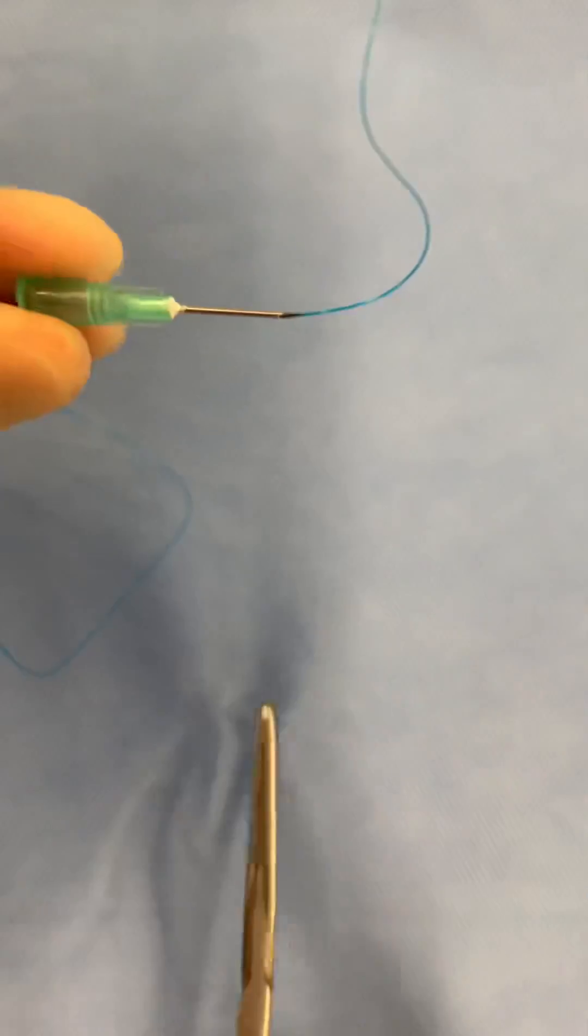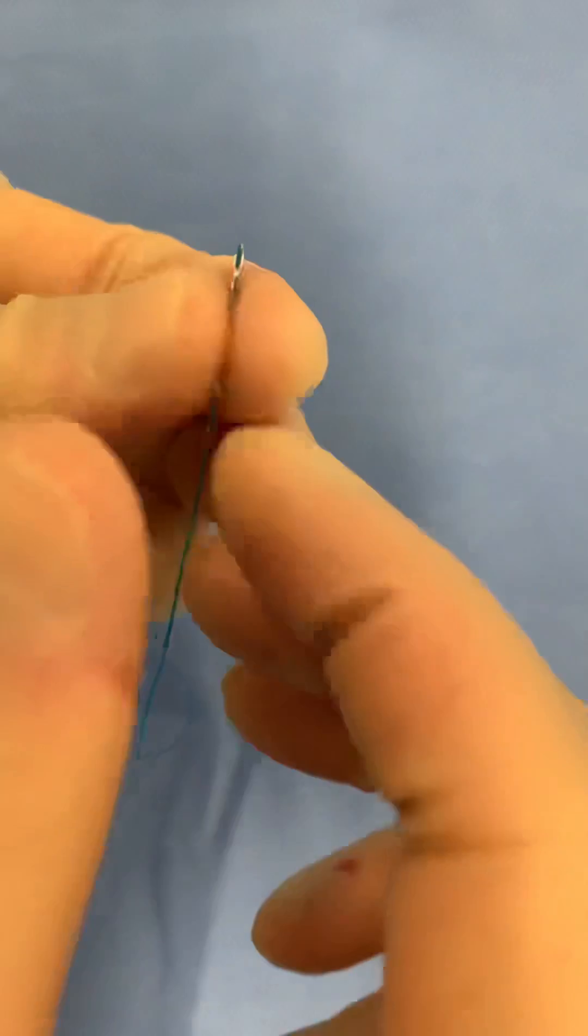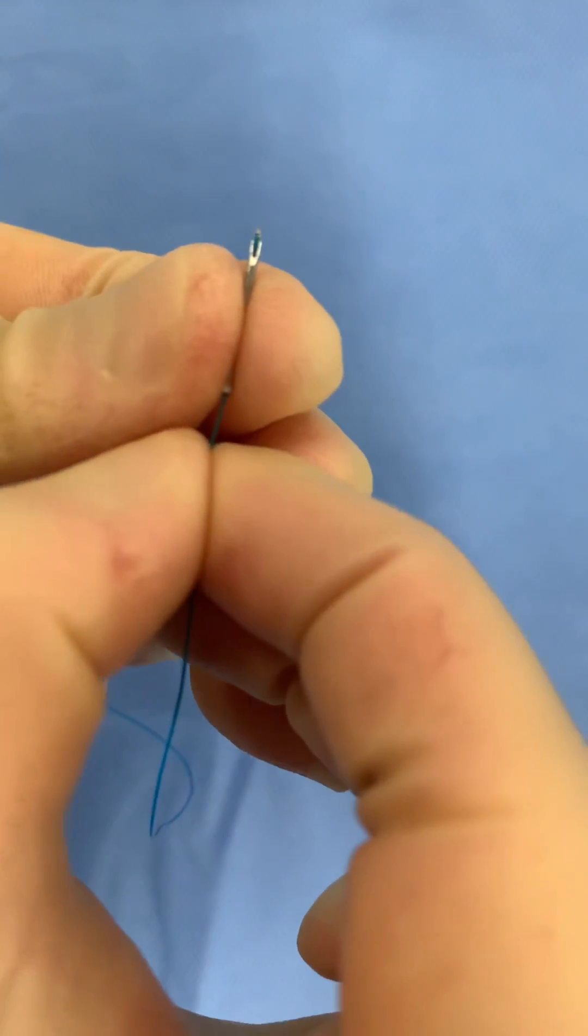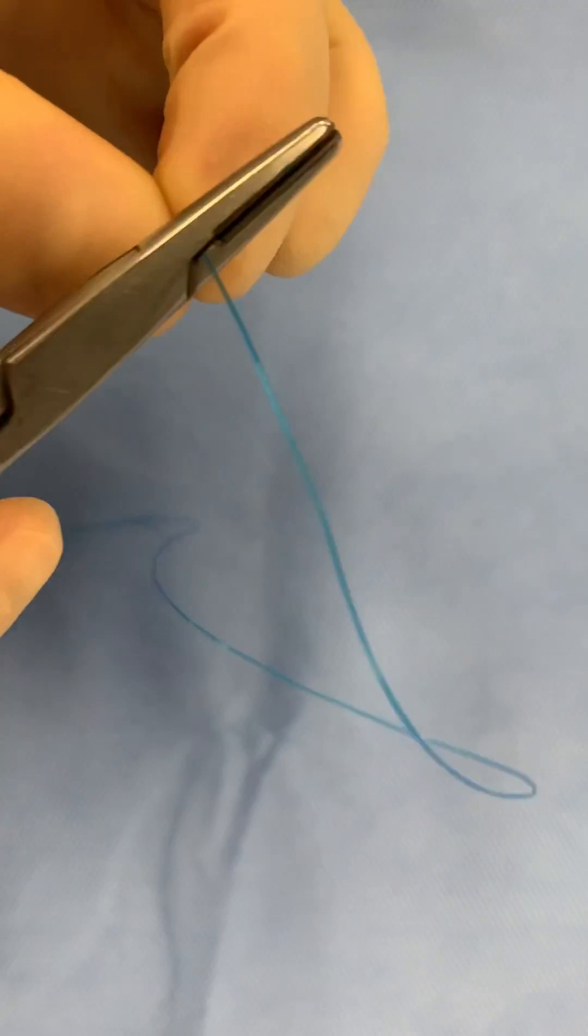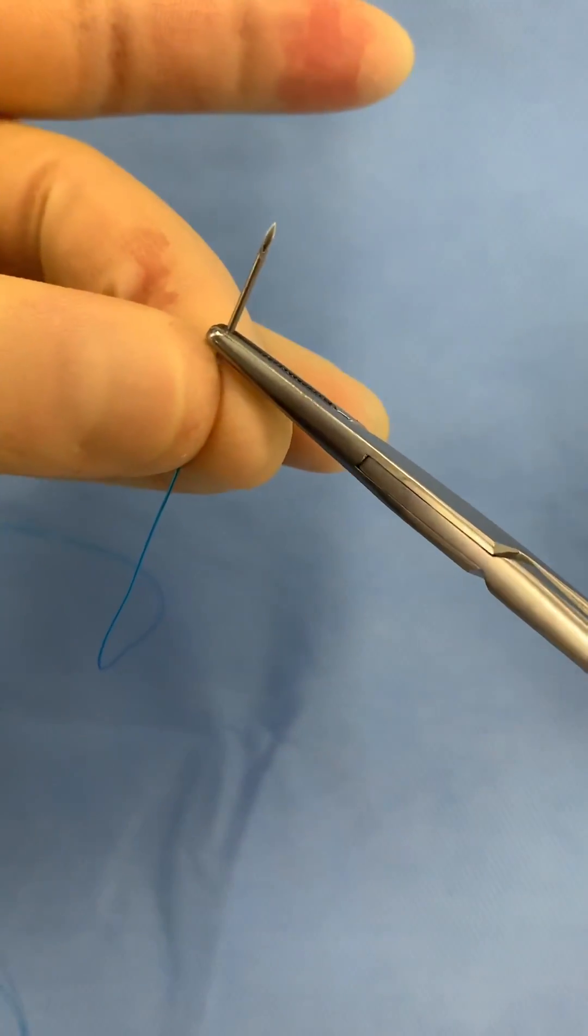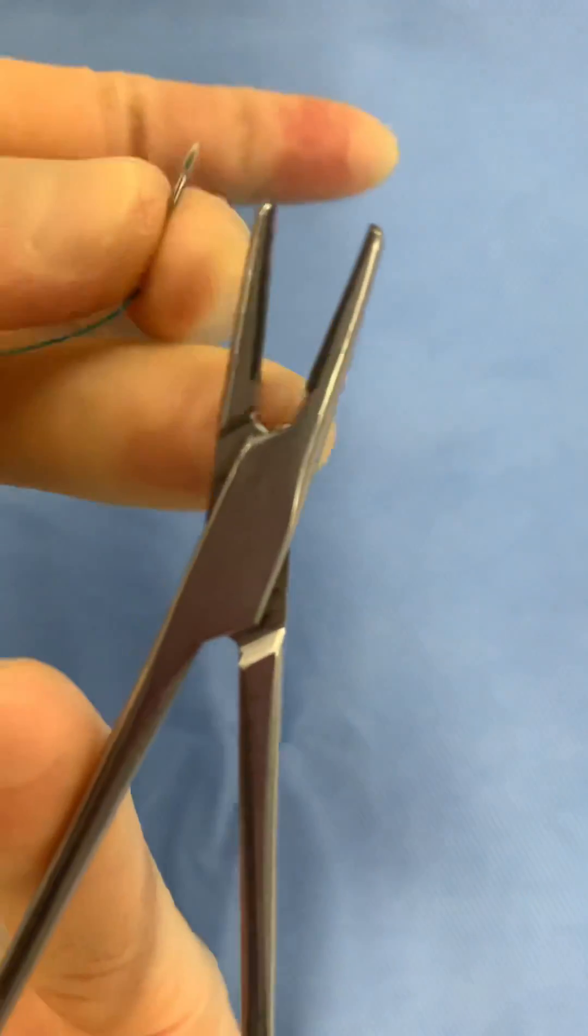Thread the hypodermic needle and break the shaft away from the hub. Pull the thread through until its end is at the dull edge of the needle. Crimp this end so it tightly holds onto the thread. If you're using a needle holder for this, use the inner edge to do the crimping.